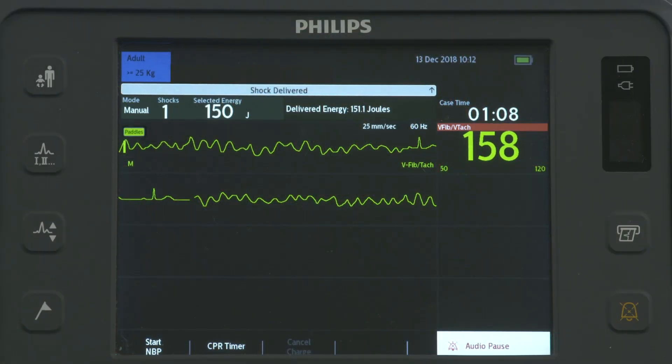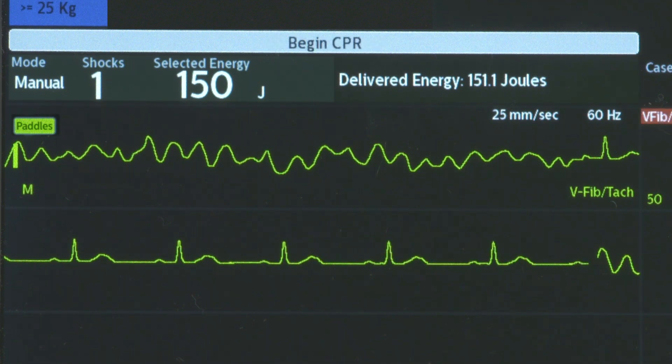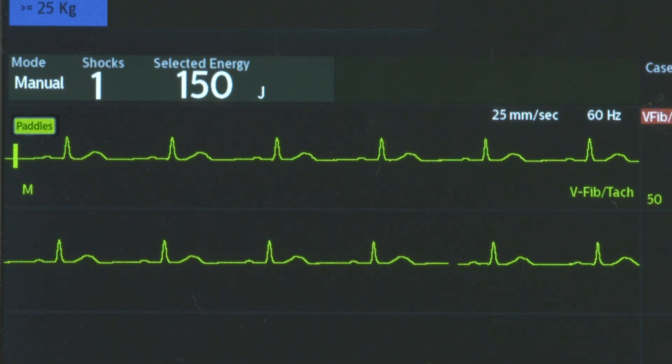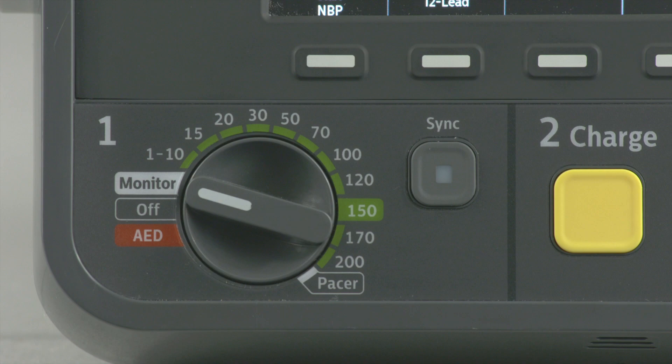Upon delivery of the shock, the HeartStart Intrepid announces, Shock Delivered. Following successful defibrillation, the Joules Delivered displays and the shock counter will increment accordingly. After you confirm a stable heart rhythm, return the therapy knob to monitor.